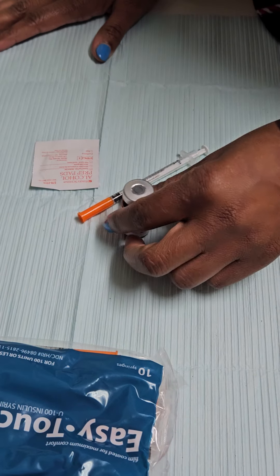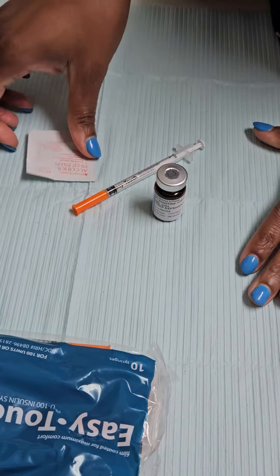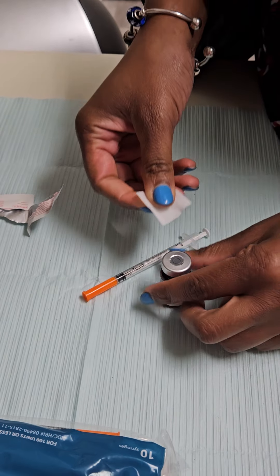First thing we're going to do — your medication will have a cap on it. We're going to take the cap off and discard that. Then we're going to open up our alcohol prep pads and we're going to clean the top of our vial.